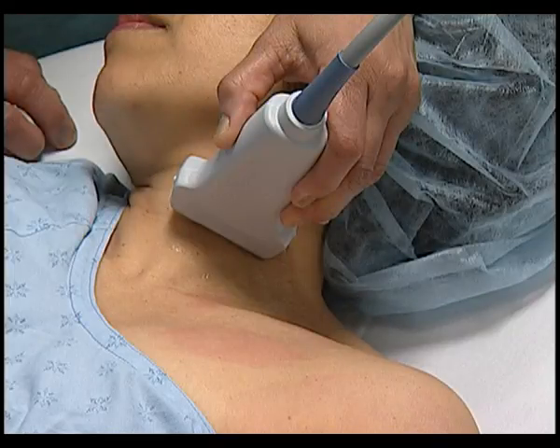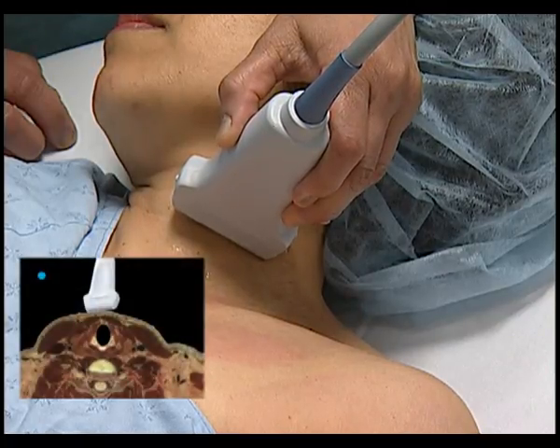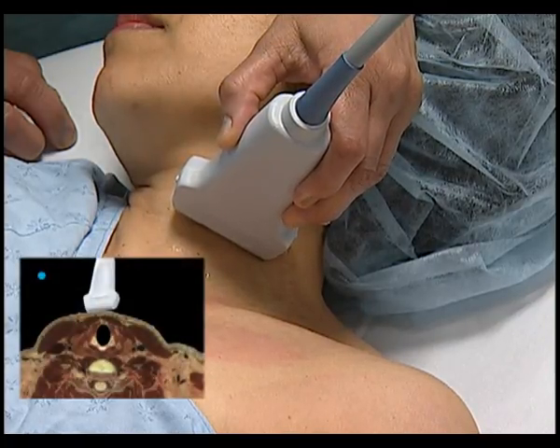There are two methods to identify the nerves of the brachial plexus in the interscalene groove. The first method uses the great vessels of the neck as a landmark. This cross-section is as viewed from the head end of the patient. The transducer is placed horizontally across the neck at the level of the cricoid.